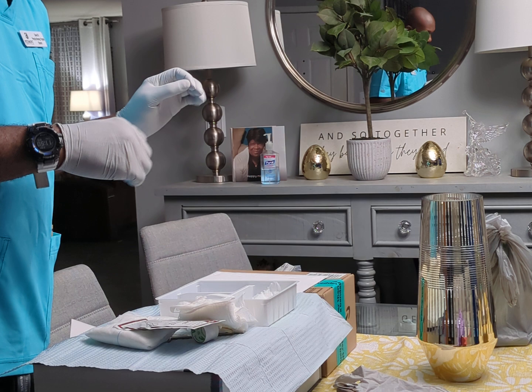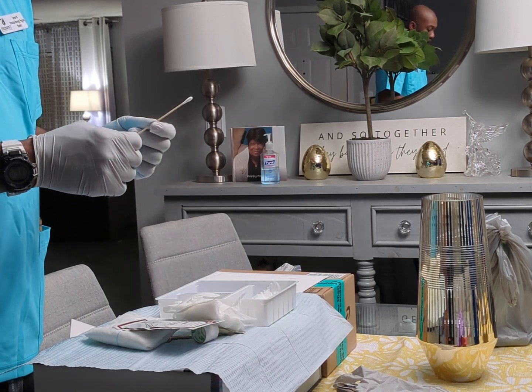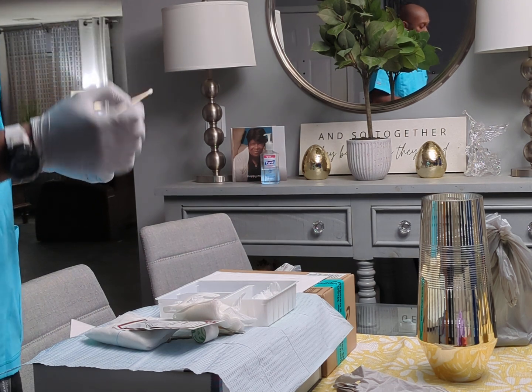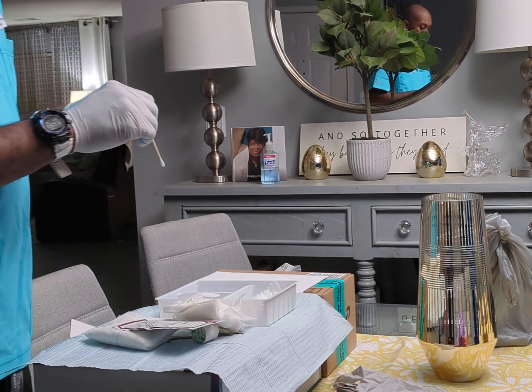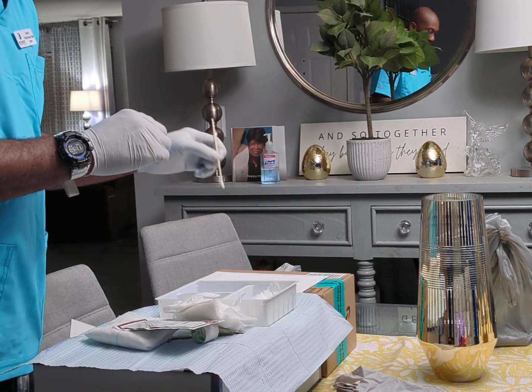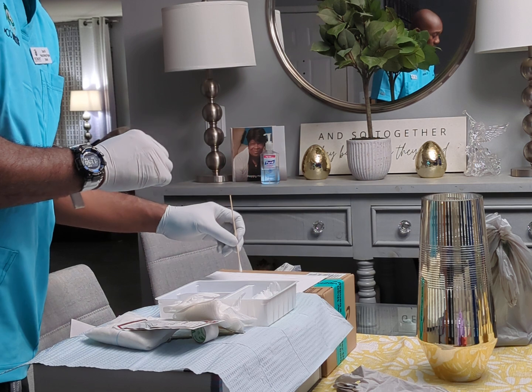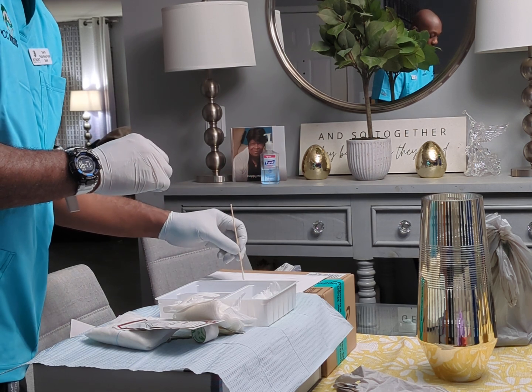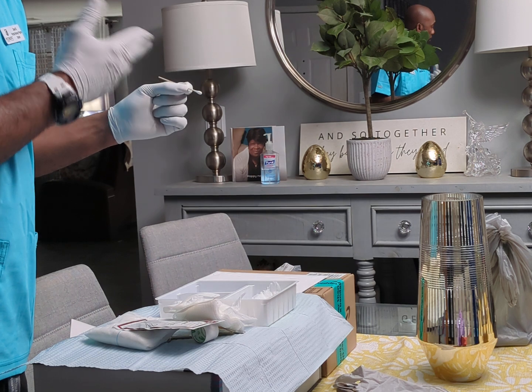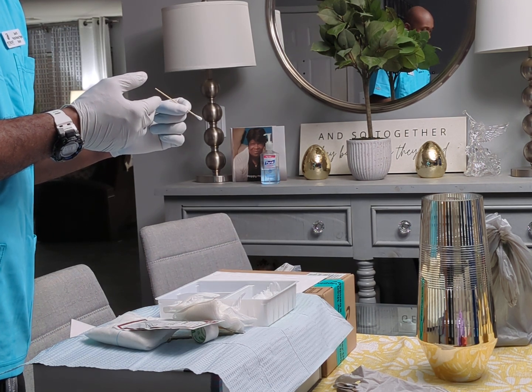Okay, so now I'm going to take out my Q-tip here, and then now I'm going to get to measuring my wound. Okay, I'm going to measure my wound. I'm going to check the depth of the wound, go down to the depth of the wound, put my Q-tip down as far as it goes, pull it up without me touching the inside of the wound.